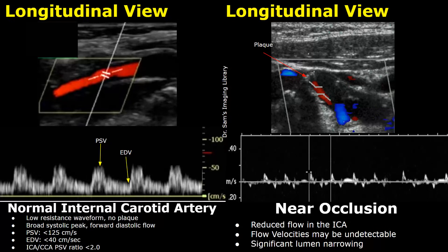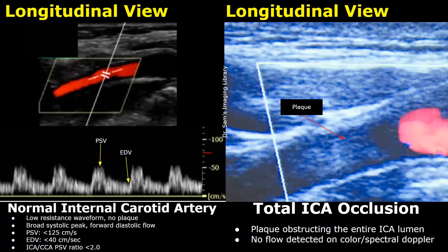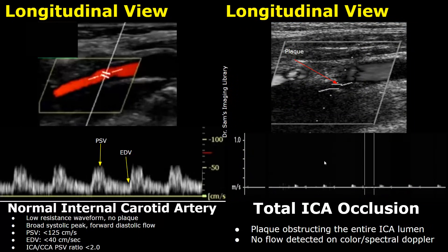In total ICA occlusion, the plaque is obstructing the entire lumen. No flow will be detected on color Doppler or spectral Doppler. In this case, no flow is detected on spectral Doppler, indicating total occlusion. The sample volume is placed at the site of stenosis and no flow is detected.